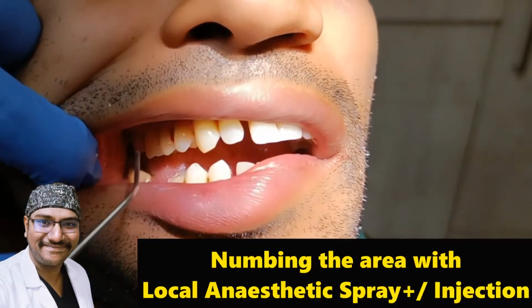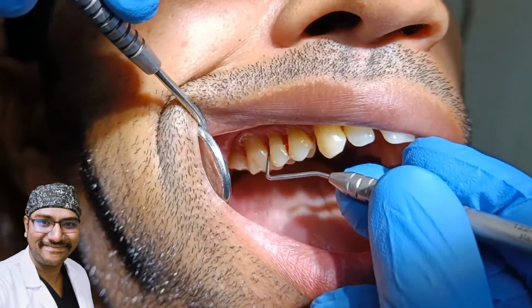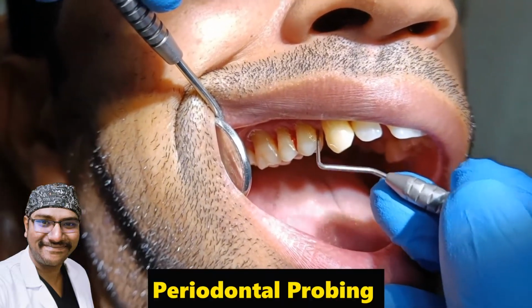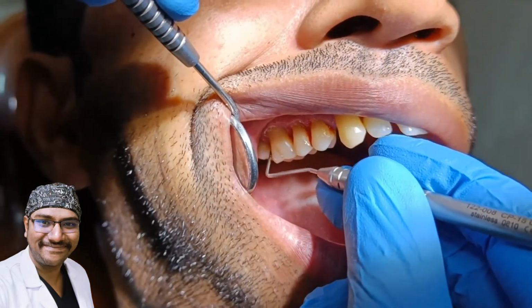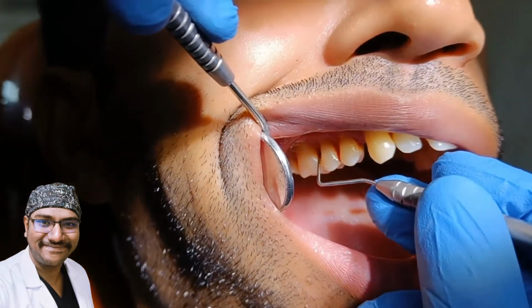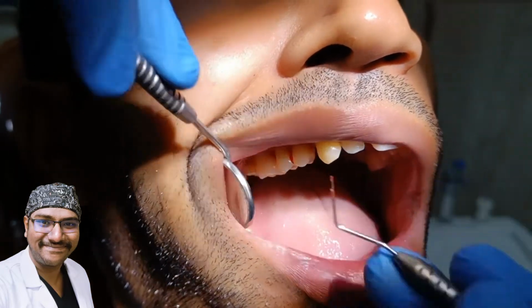After obtaining adequate anesthesia through topical anesthesia as well as injection, depending upon the pain perception of the patient, we do a periodontal probing. What is periodontal probing? We use a periodontal probe to assess the pockets and the pocket depths. The deeper the pockets, the more likelihood of the infection being more severe.